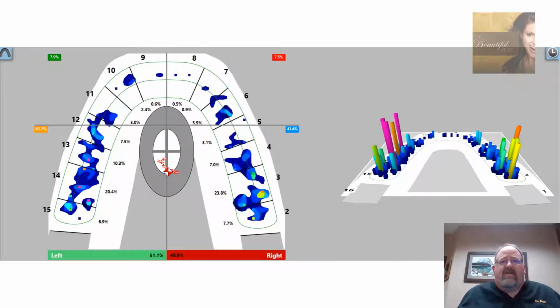So the patient's taking everything in that I'm saying, sees it on the screen, and is concerned to the point where she's like, "Well, I don't want to have to break a tooth and end up needing a root canal or a crown. This is something that I see value in and I want to take care of." So again, no talk about crazy TMD cases or symptoms or whatnot. She just wants to take better care of herself.